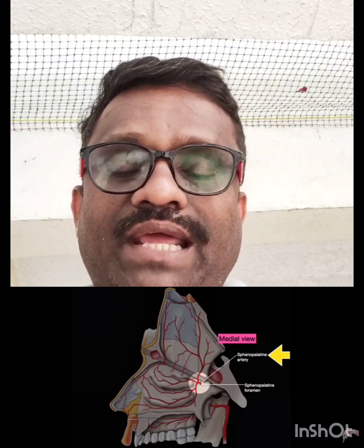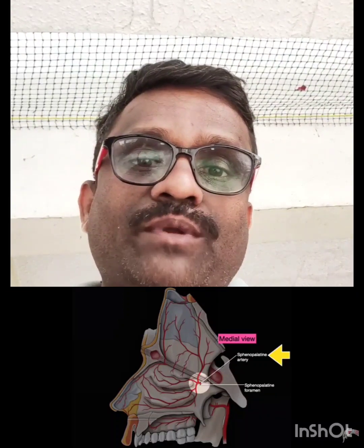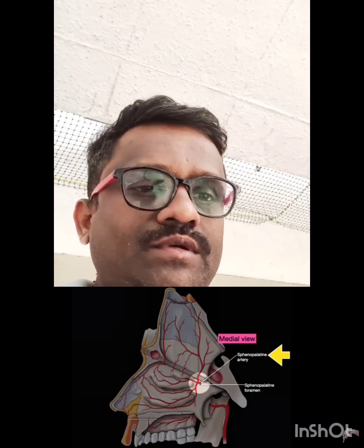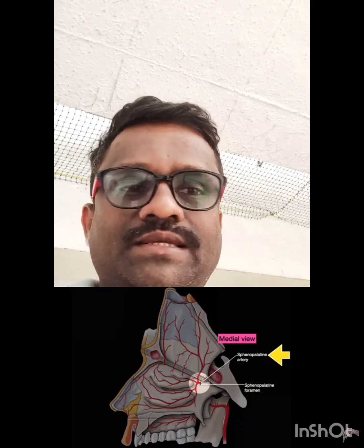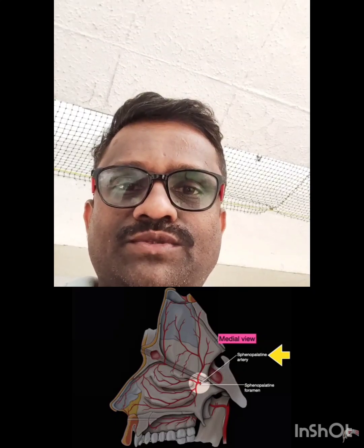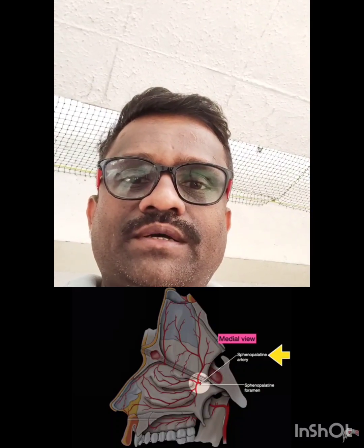Usually it gives 6 branches. One branch is to the pharynx, the second branch goes through the pterygoid canal to the pharynx again, and the third branch is the infraorbital. Coming to the anatomy of the pterygoid area, that is where we are going to place the pterygoid implants. Usually the area beyond the tuberosity of the maxilla, we consider it a good area to place the pterygoid implants, beyond the pterygoid region.